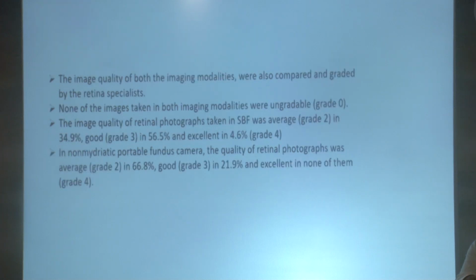Image qualities of both the imaging modalities were compared and graded by the retina specialist. None of the images taken in both imaging modalities were ungradable, as none of the patients recruited had hazy media.